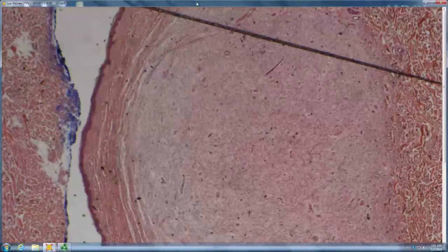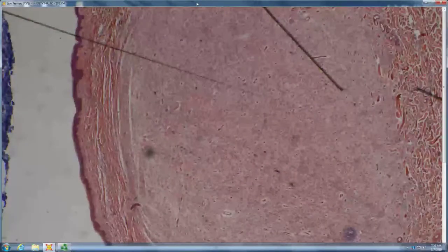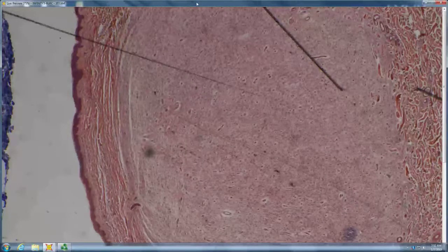So it looks like a single myxoid nodule, like a neurofibroma. Yeah, so neurofibroma, very good. Sometimes they have fascicles in them. Otherwise, they're very even in cellularity, like this, all the way across. Loose, myxoid, very uniform across the field.